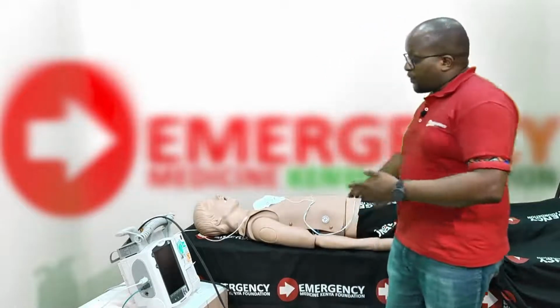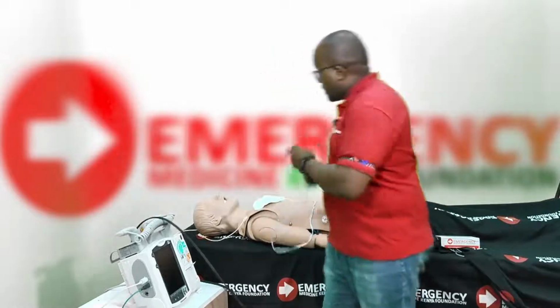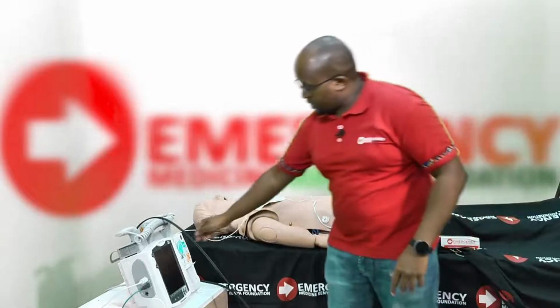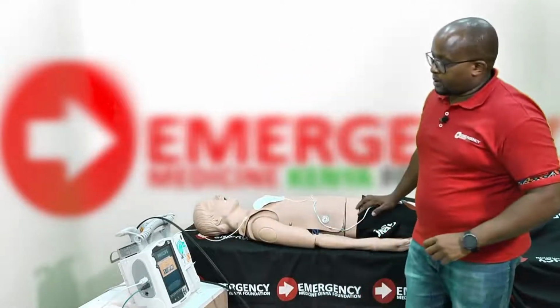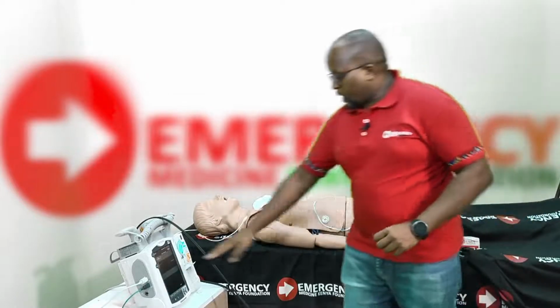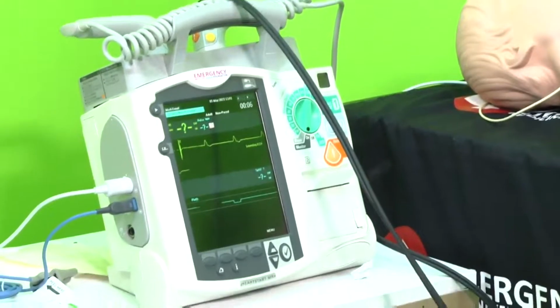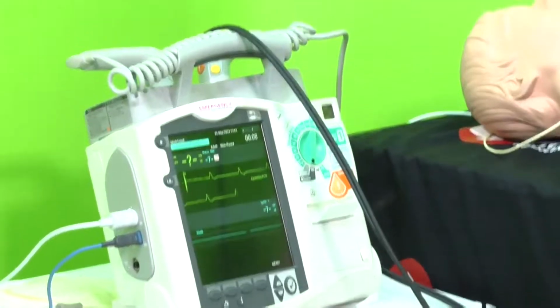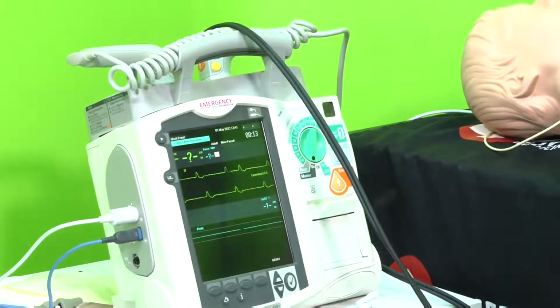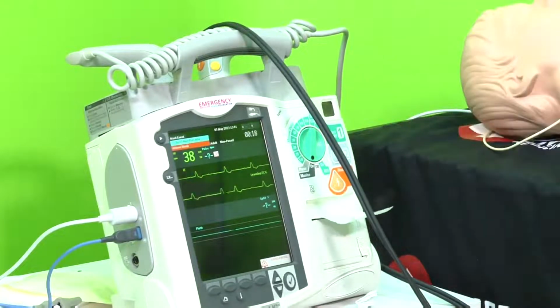All right. So we have our patient who's coming to the department. Before anything else, I've connected him to the monitor with the leads off the patient's chest. So I just switch on the monitor to see what rhythm we're dealing with. Okay, so as mentioned, I'll have the patient on lead 2. As I can see, my patient's heart rate is extremely slow. It's currently measuring 38. So my patient's heart rate is extremely low.